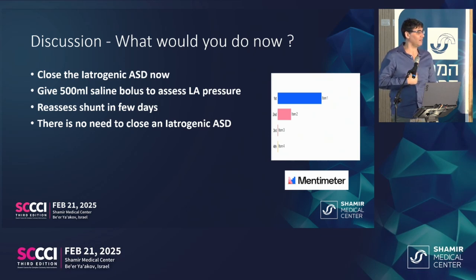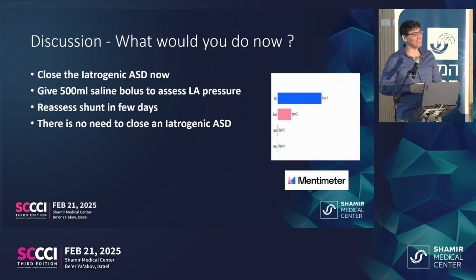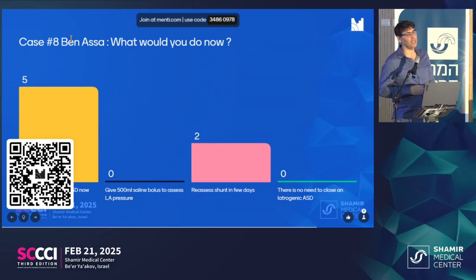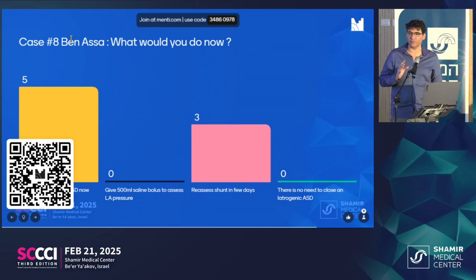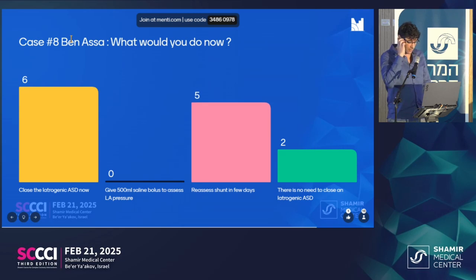How long have you been in the cath lab for now? Yeah, about five hours. It's a long procedure, as we understand, where every step you plan you need to retackle. Luckily for the TR clip that the patient is steady, also for the mitral clip, that the risk of TR is very low, and this is even in such a diseased patient.